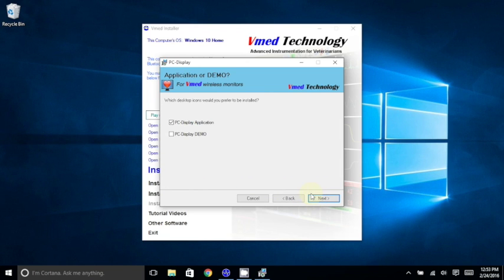This next screen allows you to choose which desktop icon you prefer to have on your desktop. You can choose one or both. We'll just keep PC Display Application selected, and then choose Next.